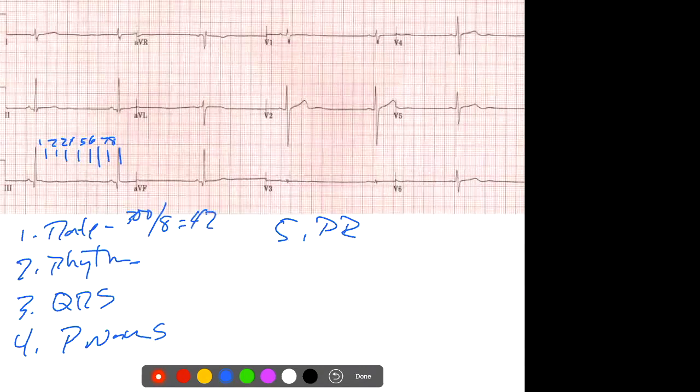For testing purposes, are you going to be putting rhythm strips in all these 12 leads, or are we going to have to count the blocks like you just did? Like a lead 2 strip at the bottom just to see the overall rhythm on a 12 lead, instead of just your separate leads, your 1, 2, AVR, AVL.